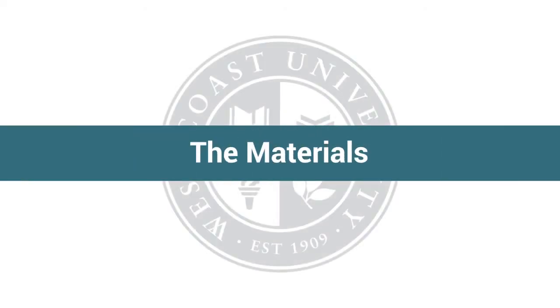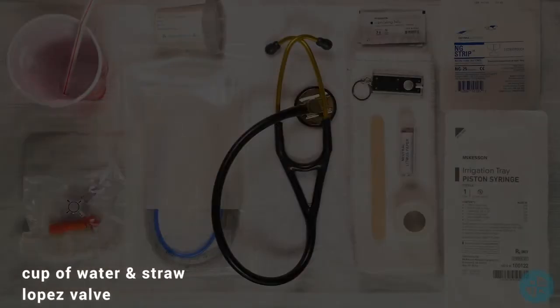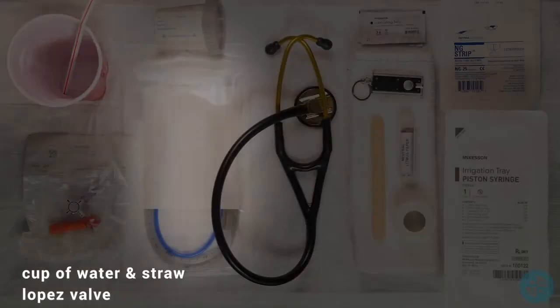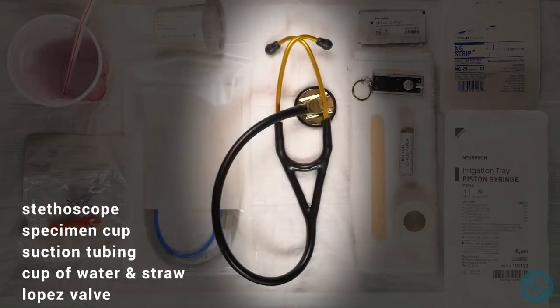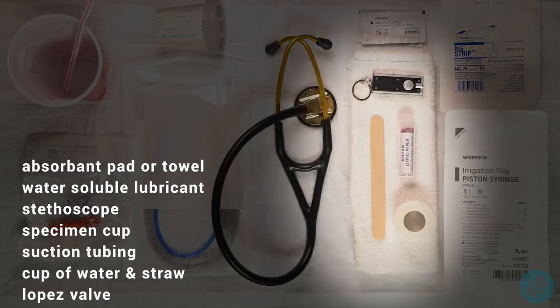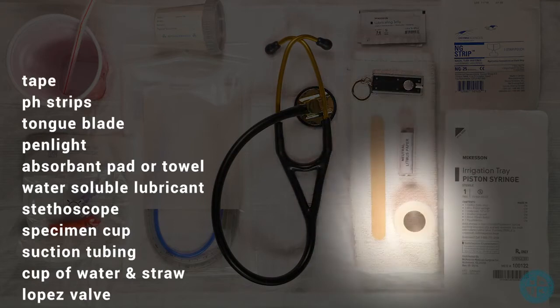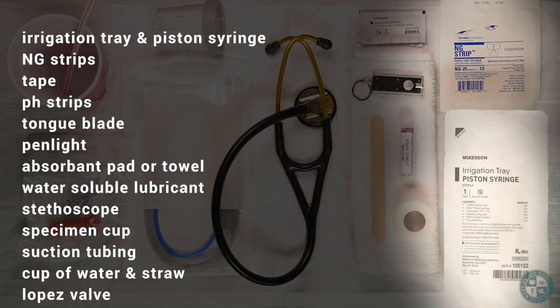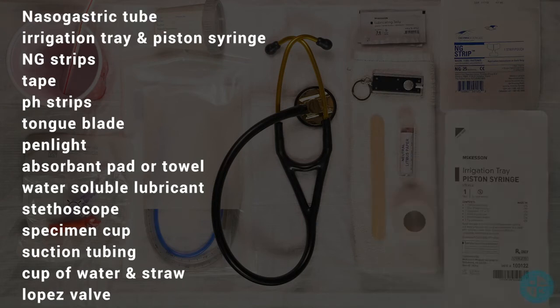Materials needed for tube insertion: Lopez valve, cup of water and straw, suction tubing, specimen cup, stethoscope, water-soluble lubricant, absorbent pad or towel, pen light, tongue blade, pH strips, tape, NG strip, irrigation tray, piston syringe, and nasogastric tube.